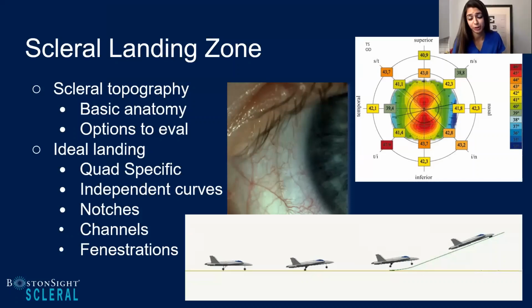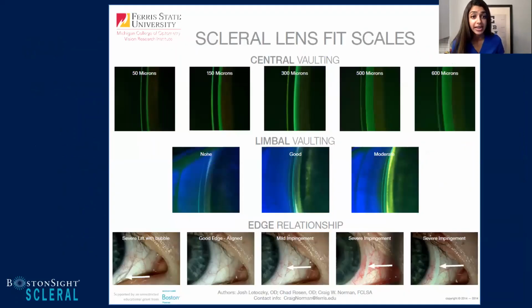Yeah, I couldn't agree more with you. So I think that the next slide, Shalu, actually shows an excellent resource. And I encourage anybody who's a new scleral lens or even a seasoned scleral lens fitter on this call to really utilize this resource designed by Ferris State, where it allows you to see the variations of central vaulting, limbal vaulting, and really understanding that edge relationship. When I first started practicing, I actually used to keep this up on my desktop, and I would use it as a comparison of looking at a lens that I had on a patient and comparing it to a standard. So this is a great resource. It's available on the Gas Permeable Lens Institute website, and I definitely encourage all to really utilize it in practice.